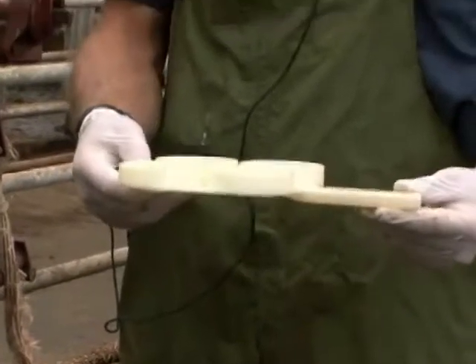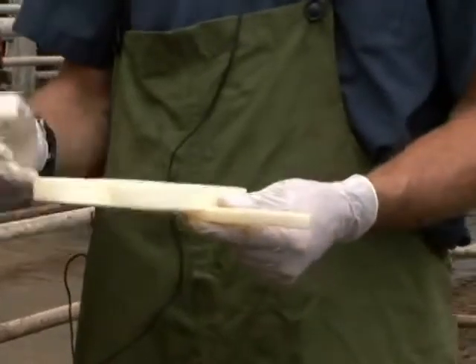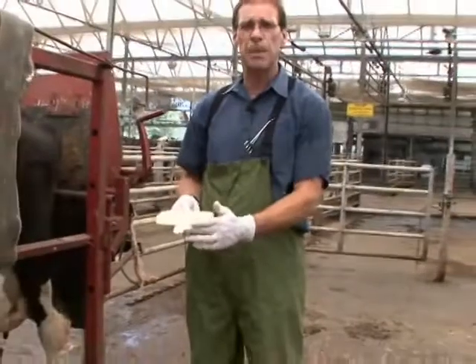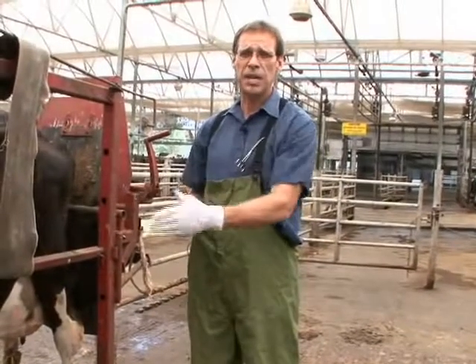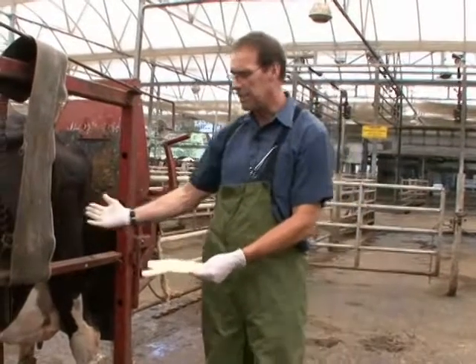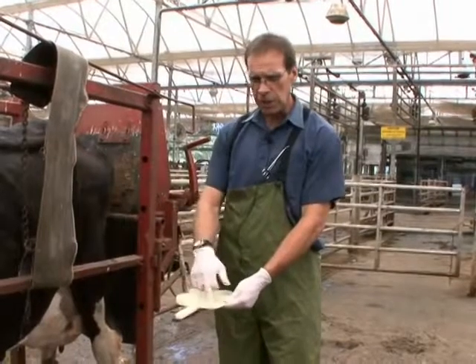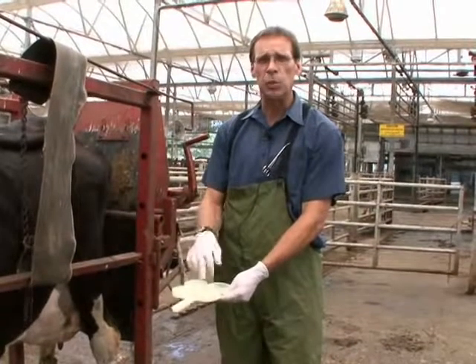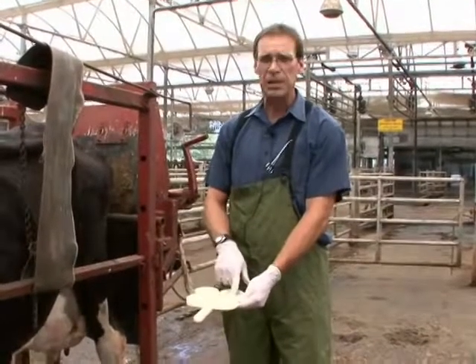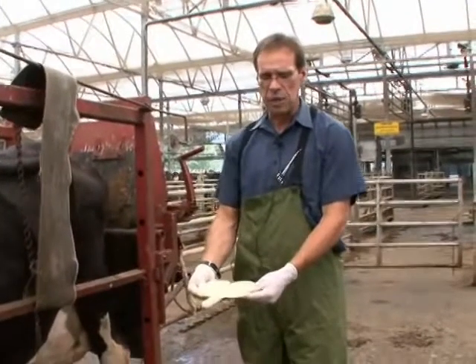But the one thing to always remember, so you don't make a mistake, when you put milk into each of these wells from each quarter, is to always keep the tongue of the paddle towards the tongue of the cow. So if we approach the udder from the left side of this cow with the tongue of the paddle to the tongue of the cow, this particular empty well, when we strip milk in, will always be the left front quarter. And this one will always be the left rear quarter, and so on with the other quarters and wells.